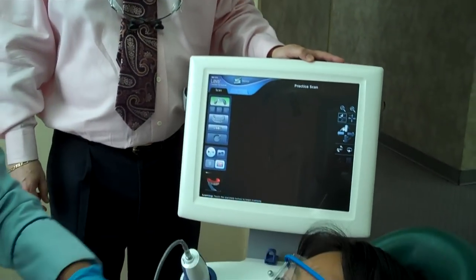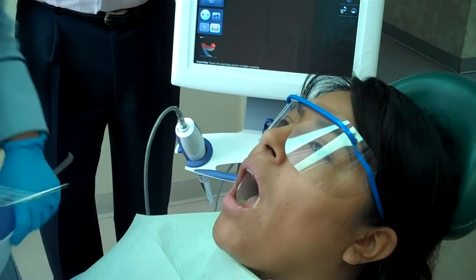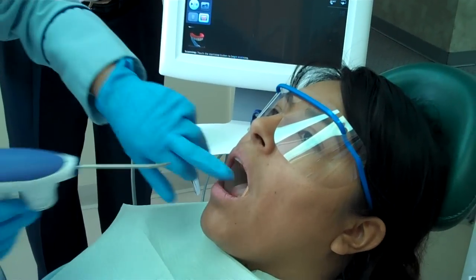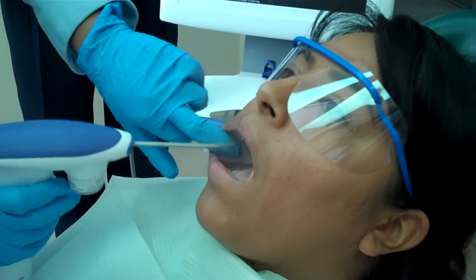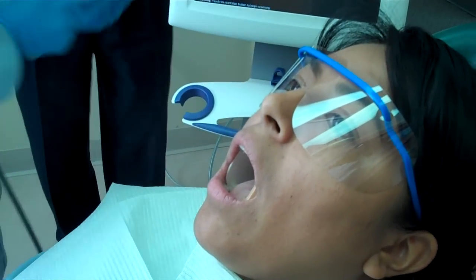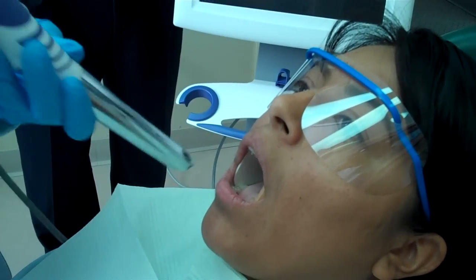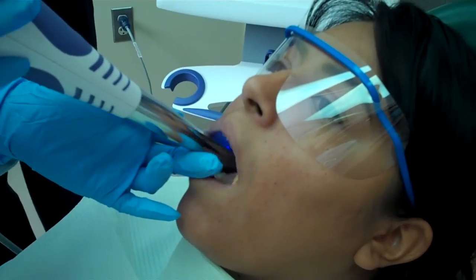Let me show you how it works. First, we go ahead and dry the area that we're going to take a picture of. And then we use a very light spray of a powder — it's a reflective powder that will allow the video camera to pick up the images of the teeth. And then we have this wand, which is actually an intraoral camera that takes high-speed images of the tooth, multiple images per second.